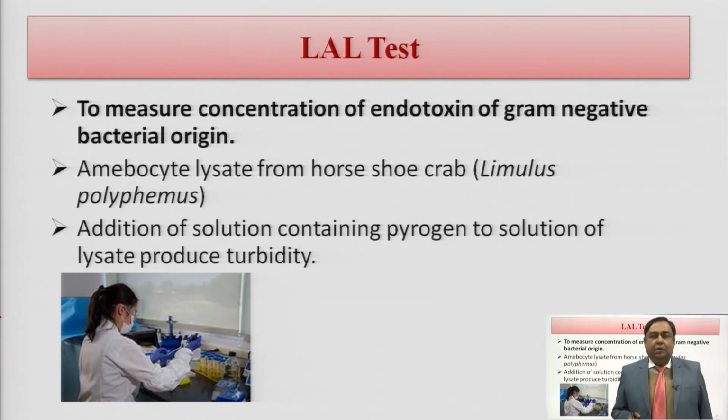That is, in the pharmaceutical preparation which you have manufactured, due to improper manufacturing, improper sterilization, improper preservation, there are situations where there is a presence of pyrogen. Now, let us define what pyrogens are. Pyrogens basically are non-volatile in nature. Mainly, they are produced by the gram-negative bacteria.